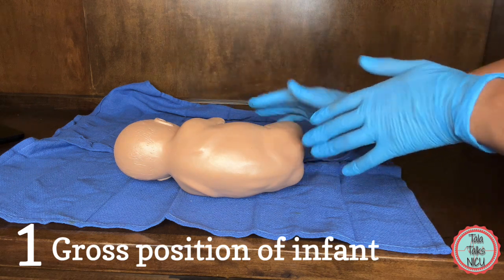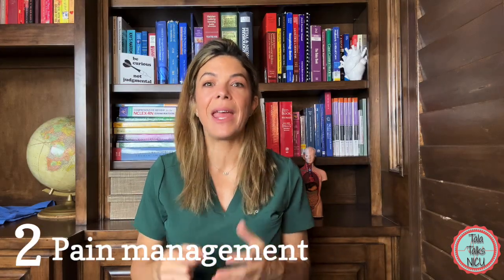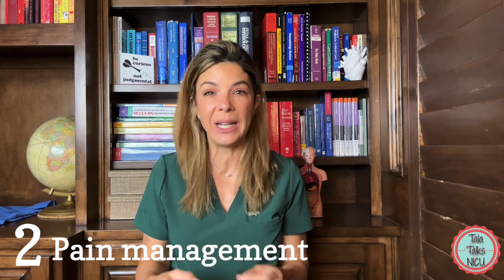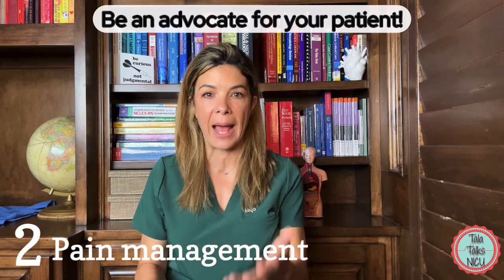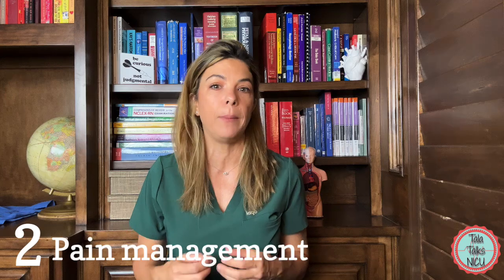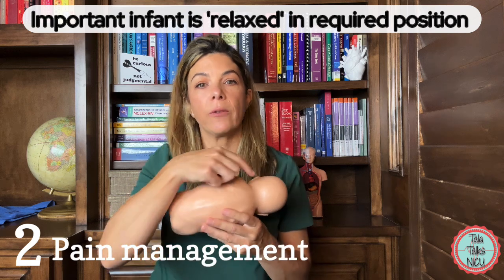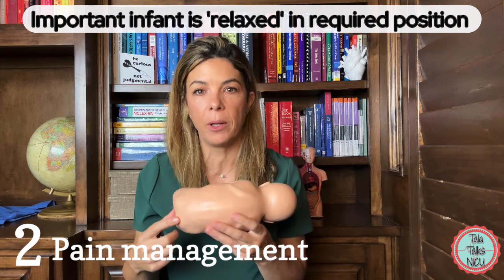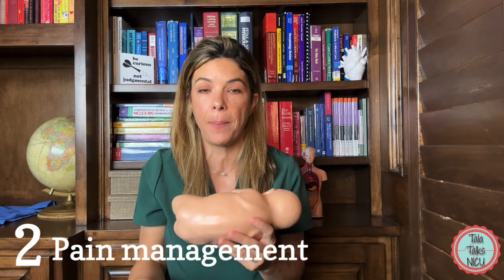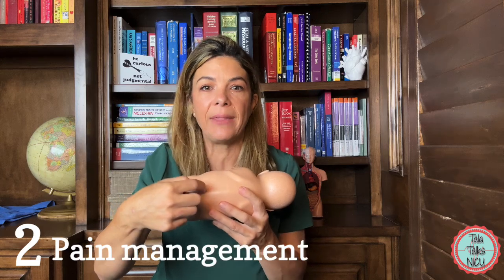Two: pain control — a really important one. Many LPs are done without any attempts at pain control, and that really shouldn't be happening. Make sure you're being an advocate for your patient. I really can't think of any situation where you're so desperate to get the tap that you don't have time to control pain in some way. We want the baby to feel soothed, relaxed, and comfortable. We don't want the baby kicking and fighting — that clenches up all the back muscles and makes it almost impossible to get the needle into the correct space.